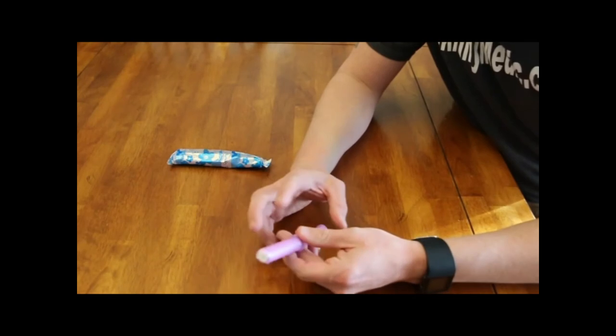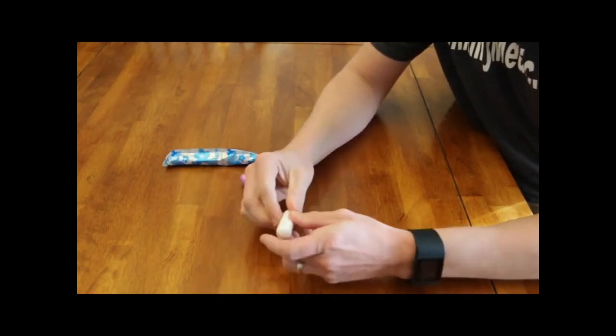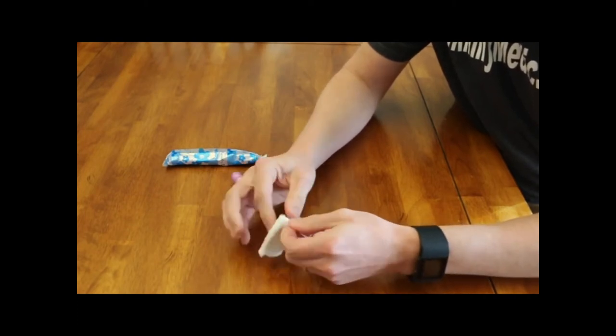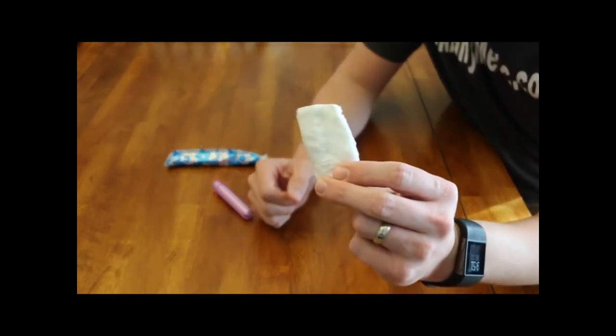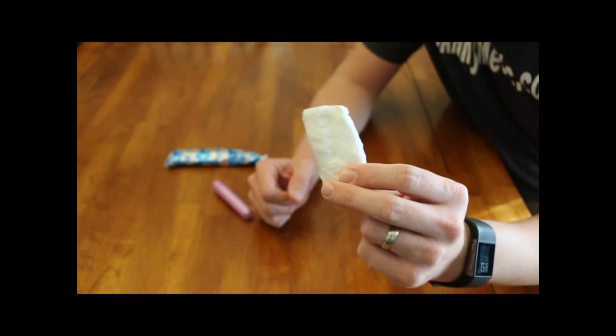All right, so I've opened one up and I just want to show you how much gauze is actually in here. So push this out, unroll it. That's about it, folks. There is how much gauze is in here that you say we're gonna control major bleeding with.